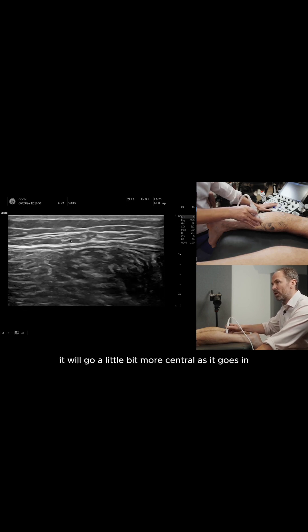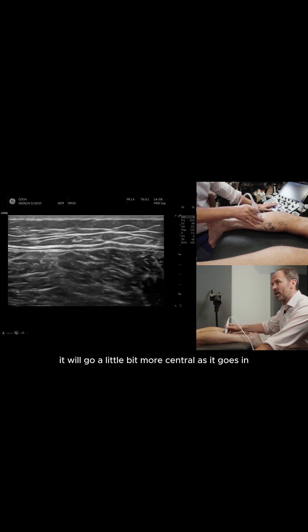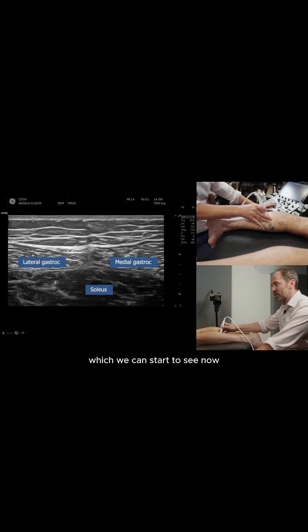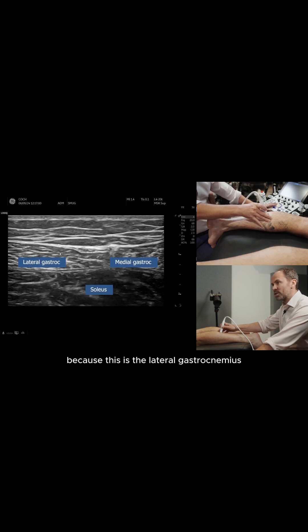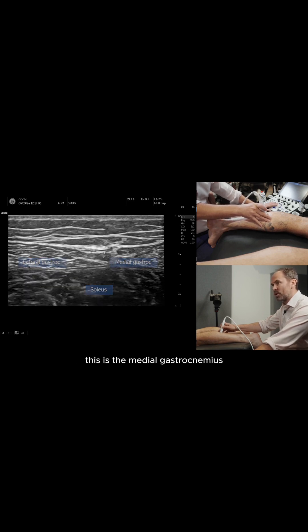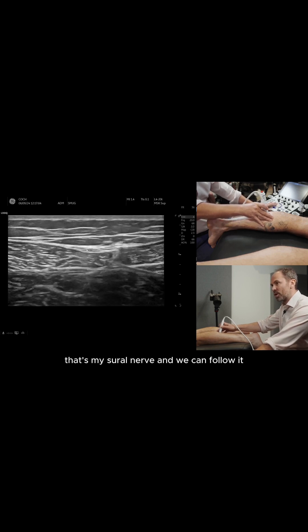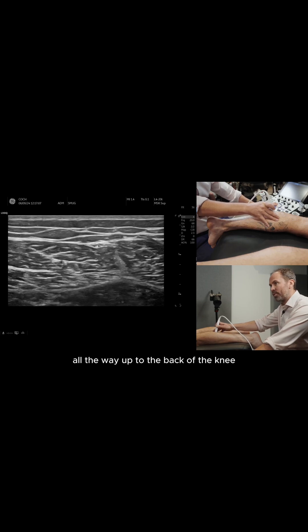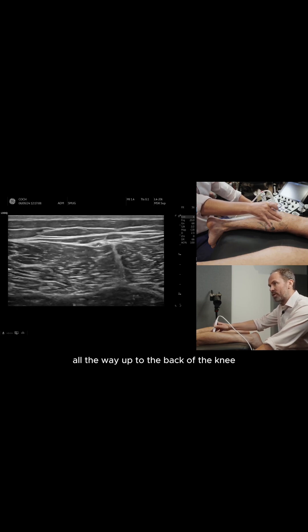It will go a little bit more central as it goes in between the intramuscular tendon, which we can start to see now. This is the lateral gastroc, this is the medial gastroc — that's the sural nerve and we can follow it all the way up to the back of the knee.